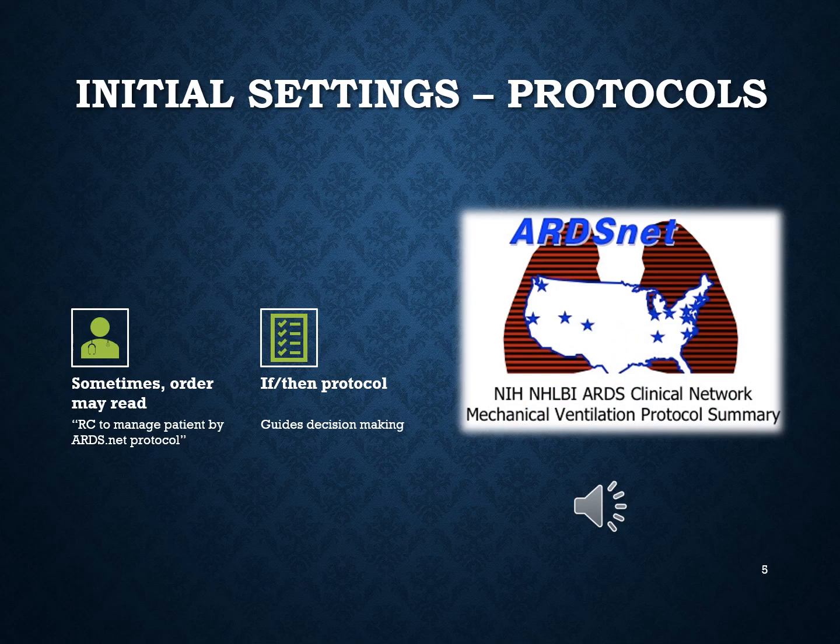Each facility is different, so there are many protocols in managing a ventilator along with the initial settings, but there may be times where you'll have an order that reads respiratory care to manage the patient by the ARDS.net protocol. And what you'll simply do is follow this website, adjust your patient's settings according to that protocol.